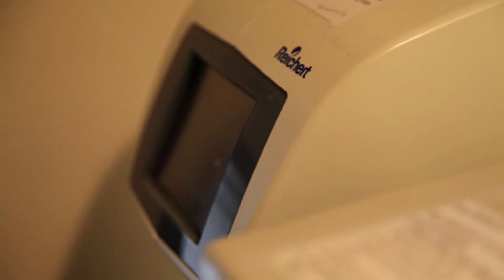So what you'll do, very first thing, is wipe down all the instruments. We have alcohol pads here. You'll grab an alcohol pad and wipe down all the instruments.